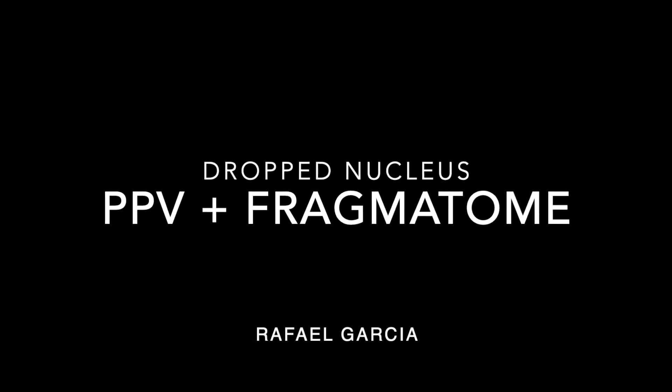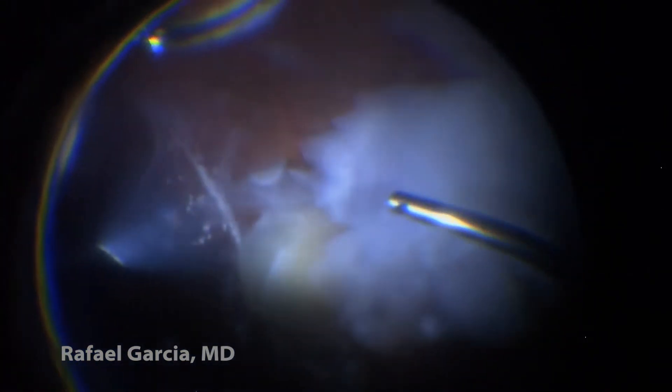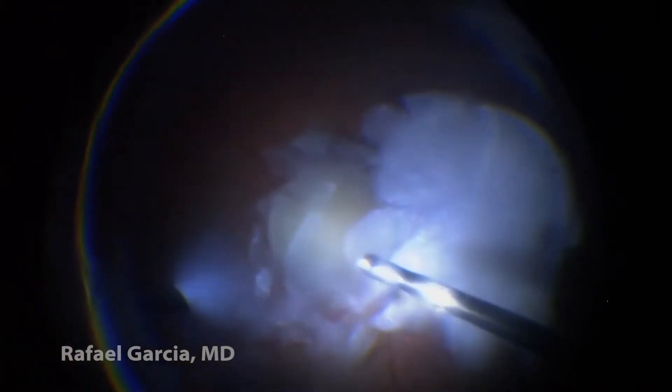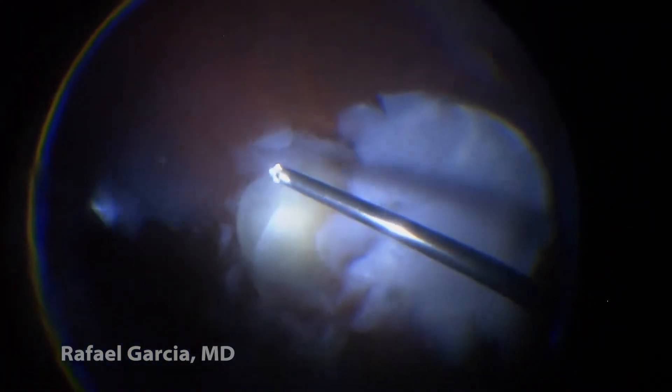This is a short video to show the management of a hard and wide dropped cataract. The first step in such cases is always to perform a good core vitrectomy to release any vitreous strands adherent to the nucleus. This is important to avoid causing traction and thus retinal tears that could eventually lead to retinal detachments.